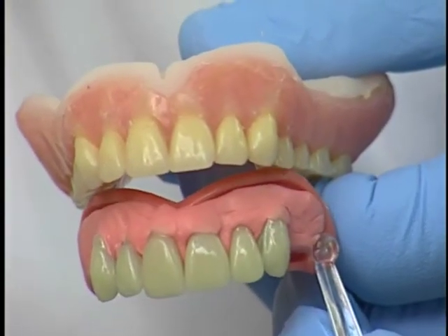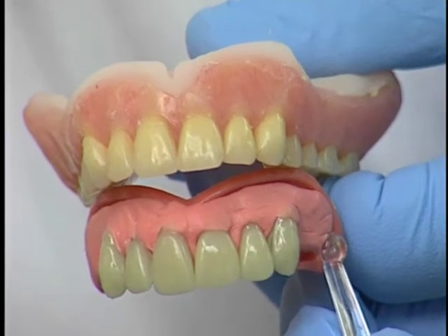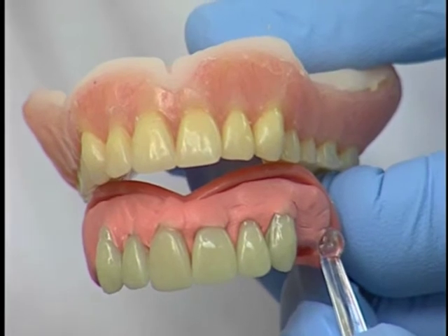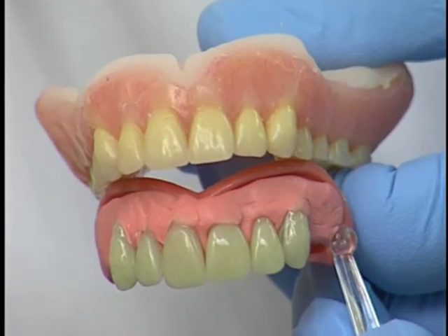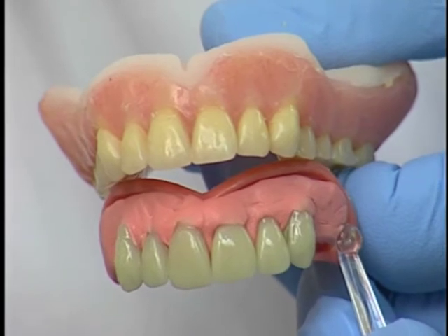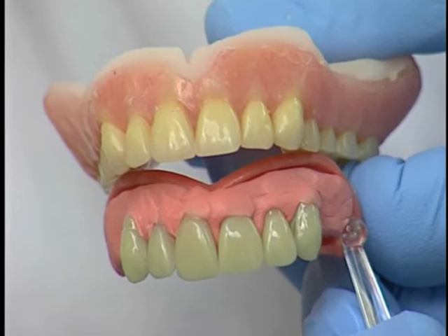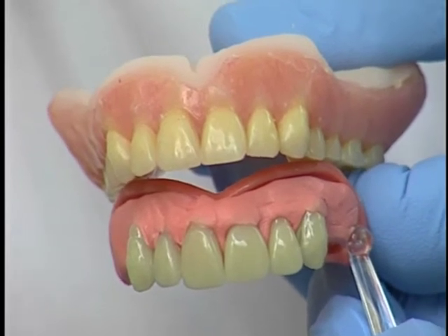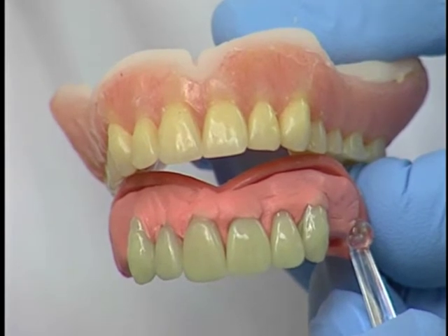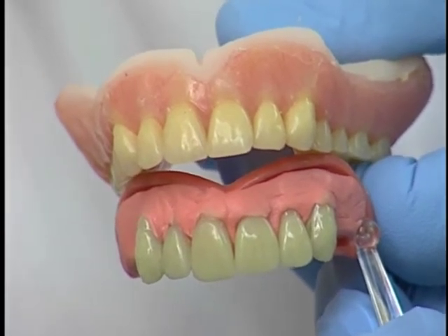Now we compare the mold we selected to the patient's old dentures to see if there has been a change. The teeth are very, very similar — perhaps even the same mold. It appears that in the old set of dentures a good job was done on selection of teeth, and we have independently come up with a mold very similar to the original.